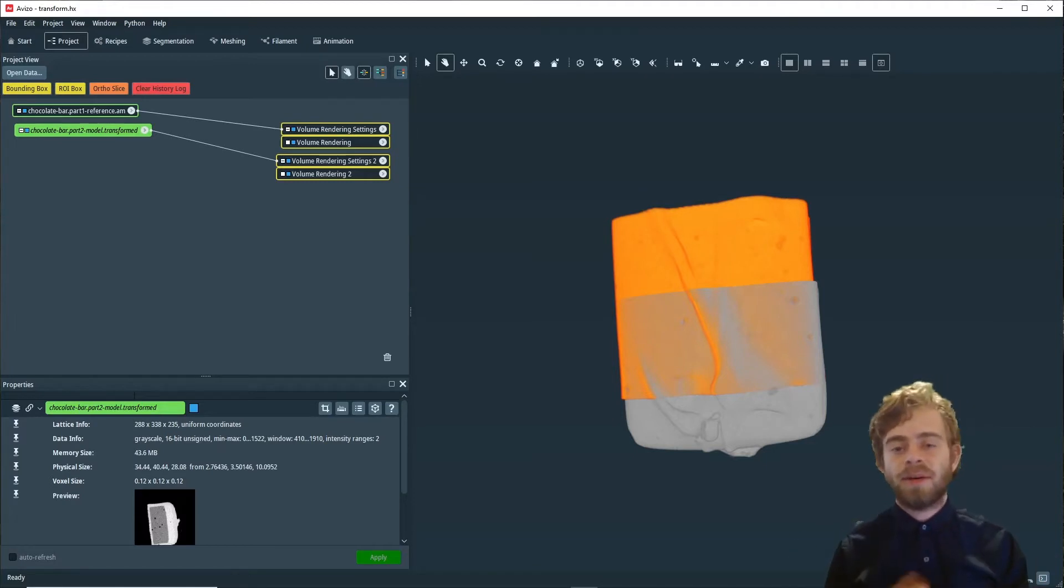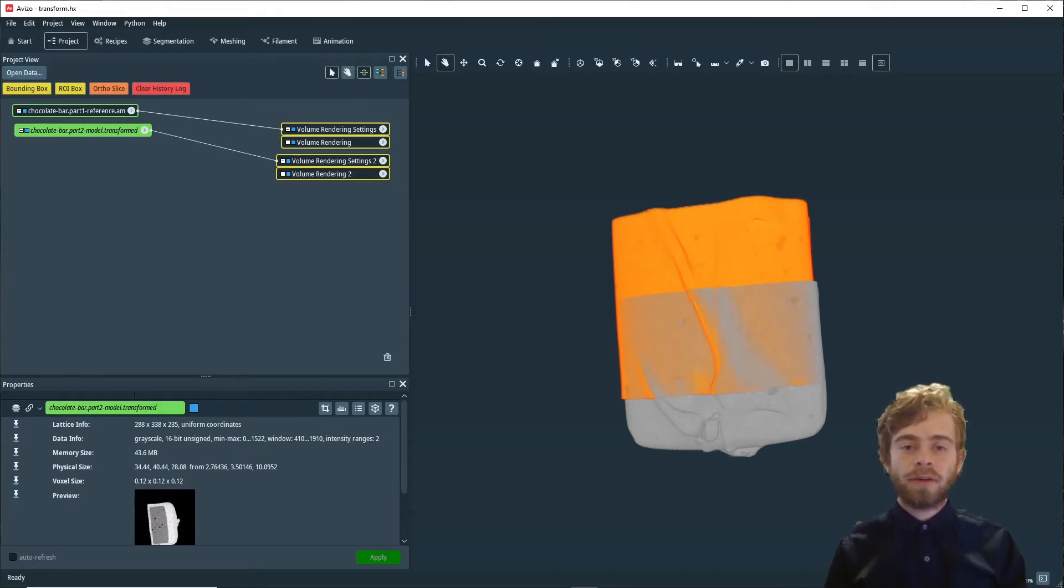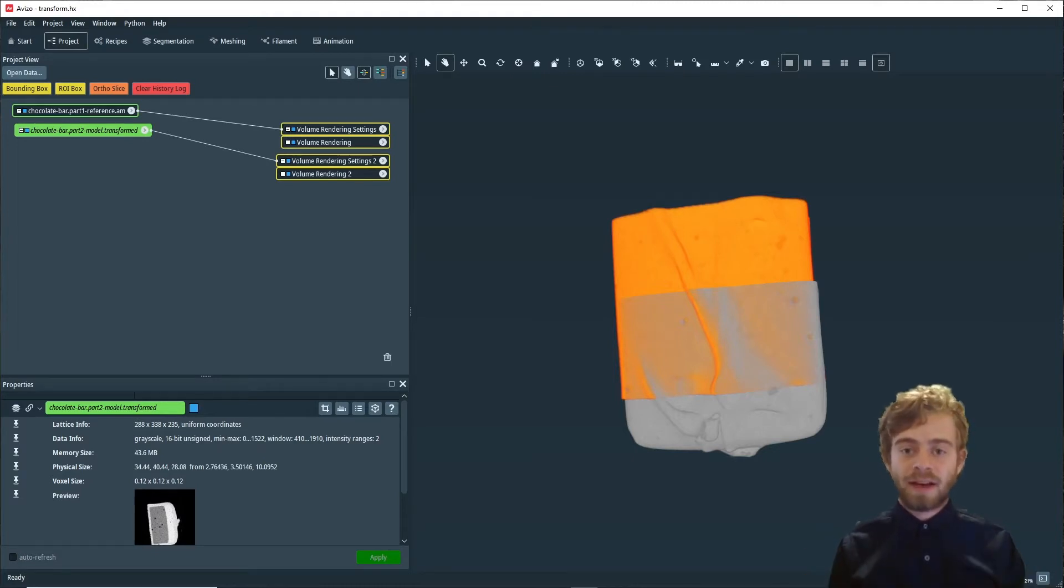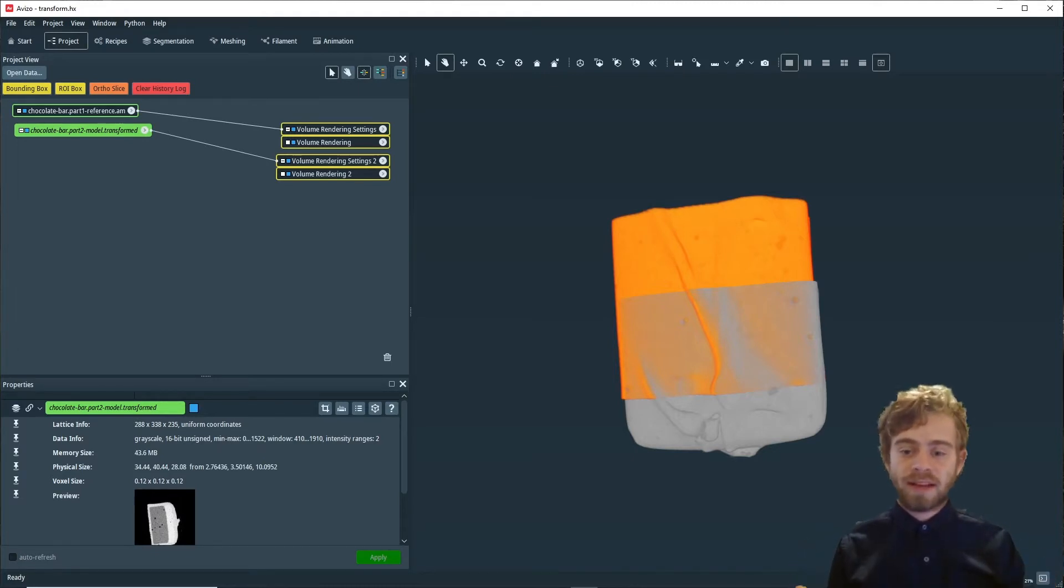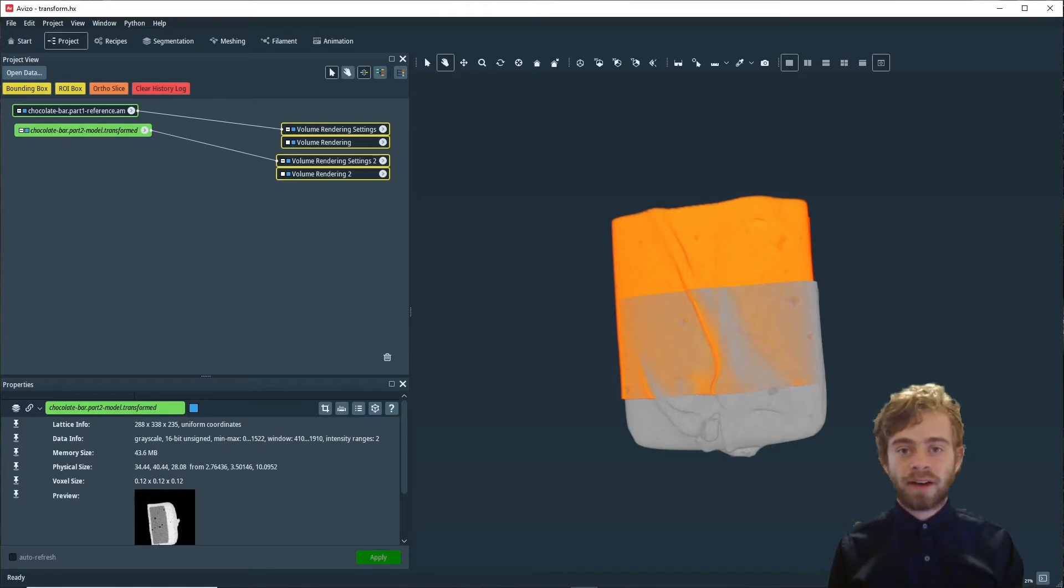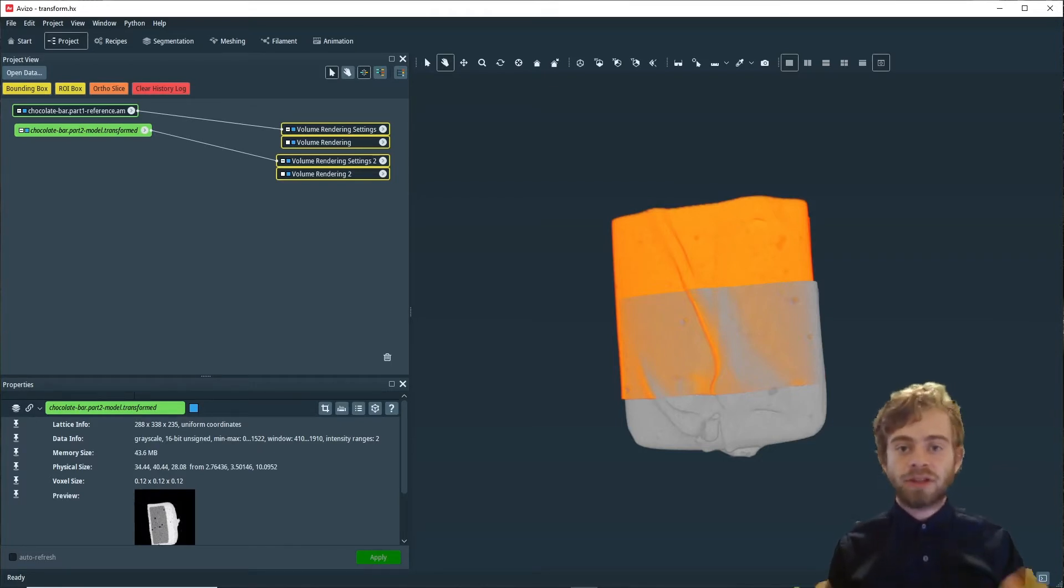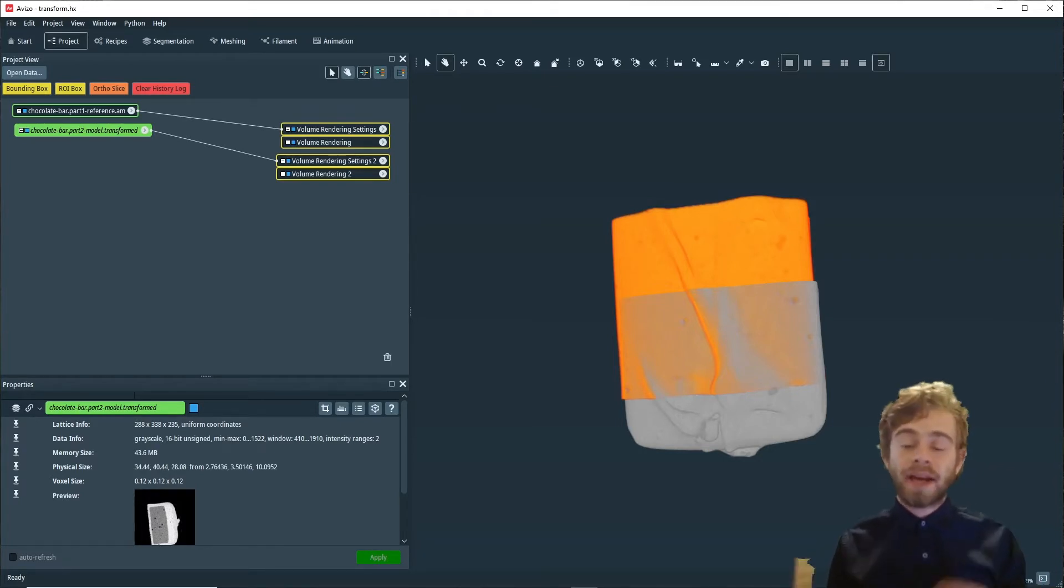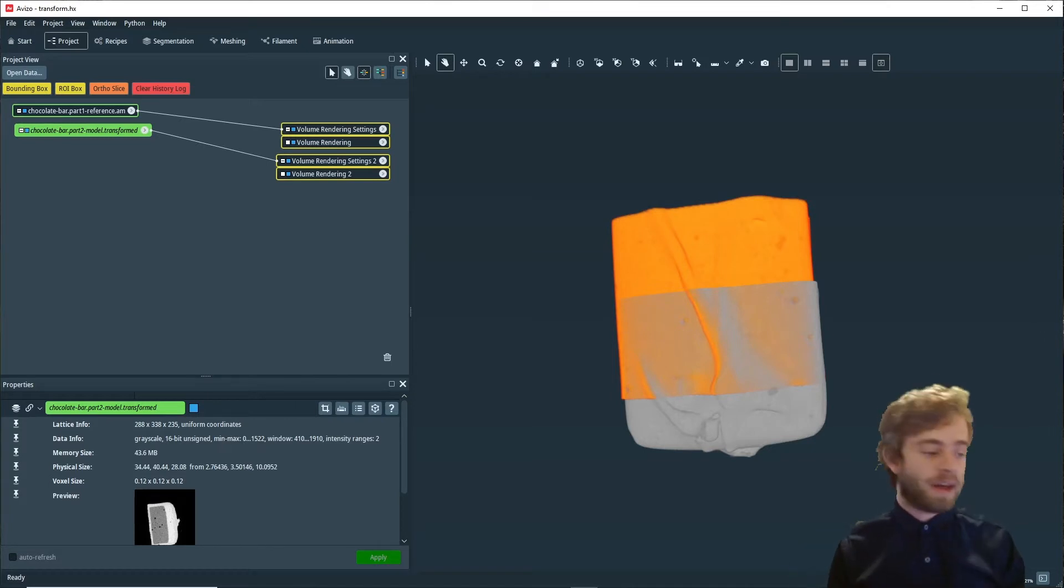This is the second video in a two-part series. In the first video, we went over how to approximately align two parts of the same dataset using the transform editor. If you don't know what that means or don't know how to do that, I suggest you check out that part before watching this video.